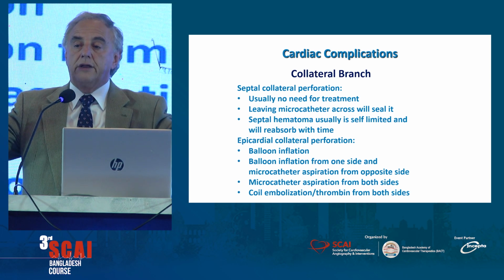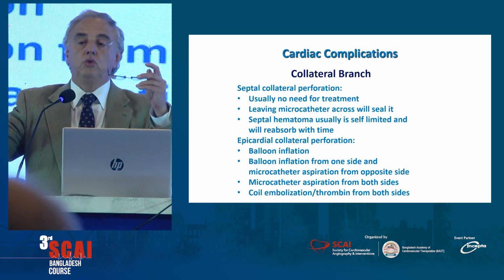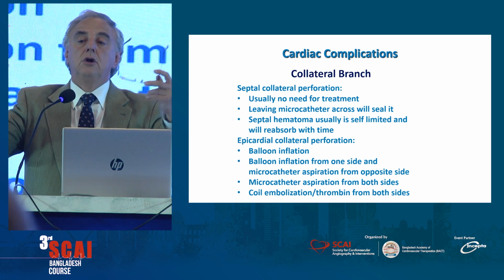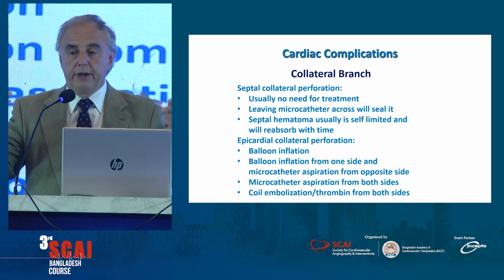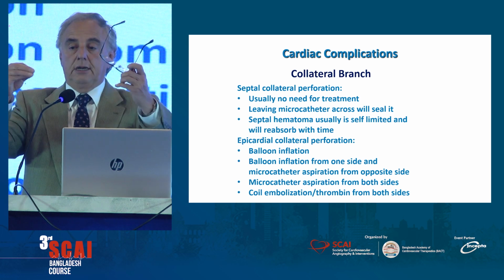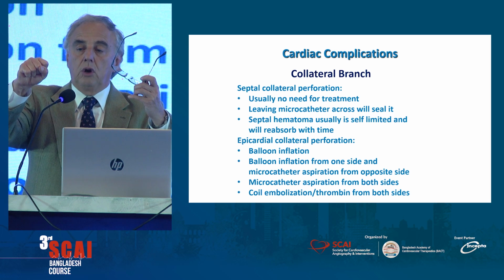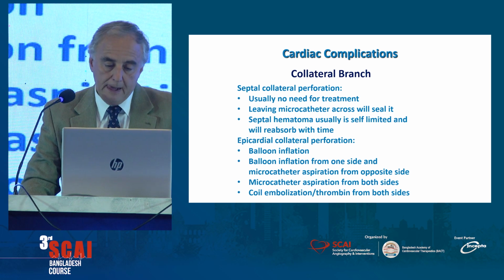You remember the epicardial receive circulation from both arteries. You will need to be aware of that, and you will need to coil from both sides, or you can use a microcatheter from both sides by putting it in there and aspirating. Sometimes it produces sucking of the collateral, and the collateral will close. You just leave it like this for a few minutes, and it will close.